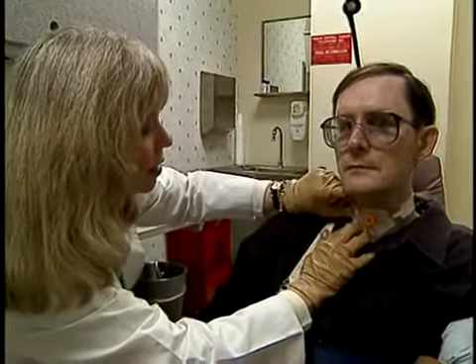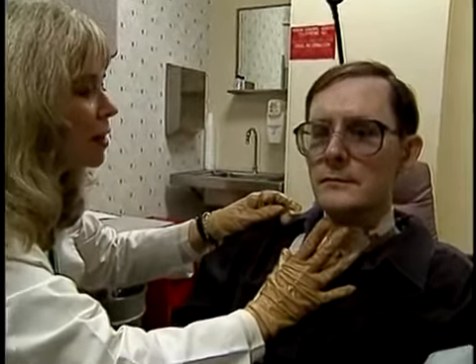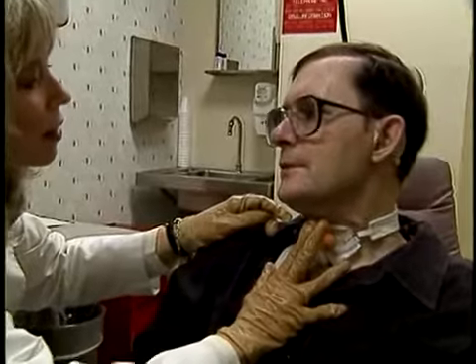A tracheostomy can raise many quality-of-life issues for patients. Finger occlusion is a very conspicuous action and prevents patients from using their hands while speaking. Difficulty with communication, as well as secretion management and swallowing problems, can discourage patients from attempting to socialize or interact with others. When using the valve, patients can breathe, speak, and use their hands more normally without drawing attention to the tracheostomy.